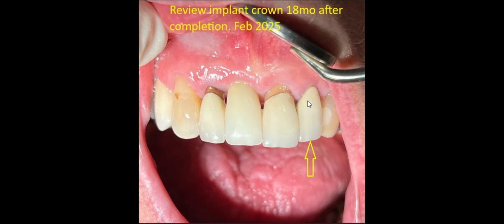But you can see from the grafting procedure, we've generated a very natural looking, naturally emerging tooth form, and this is obviously what we're after, because indeed she had not enough bone in the area after the extraction for us to even place an implant.